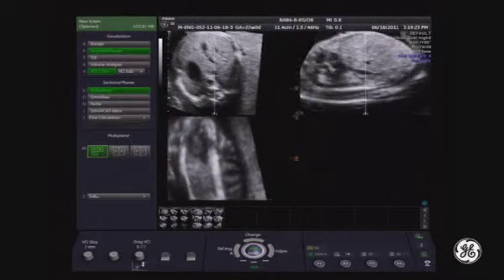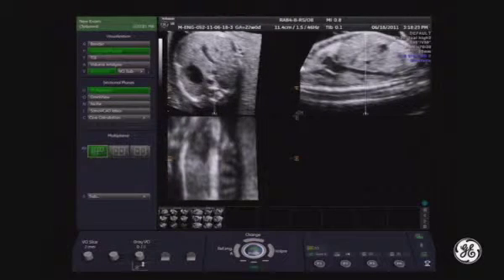And I will check the position of the spine. Here I will expect a dot, a bright signal, because of one of the trunks. And here you have the line of the spine in coronal view and another line in the sagittal view. I will correct the sagittal view a bit, so the B plane.